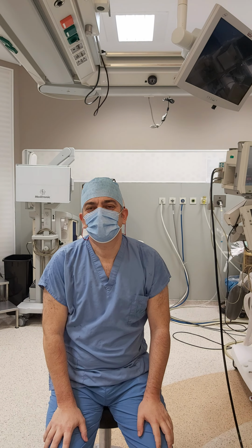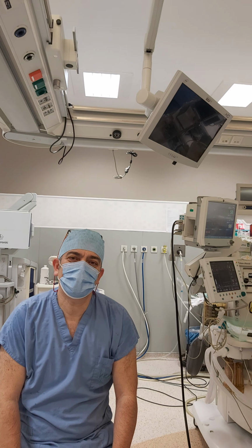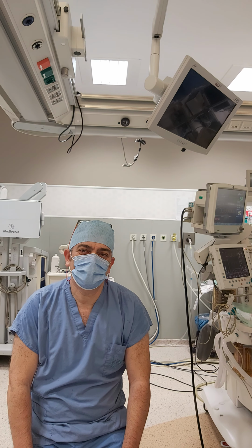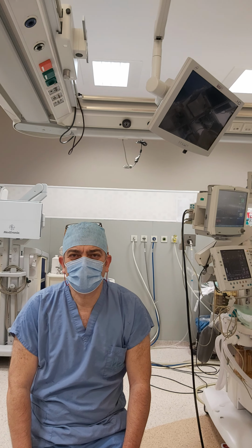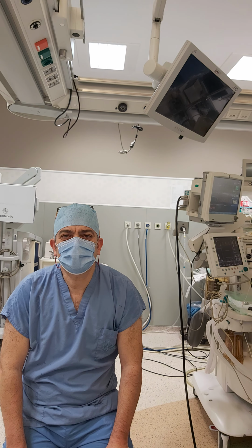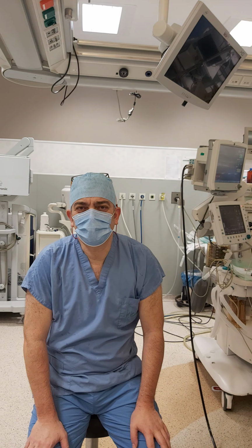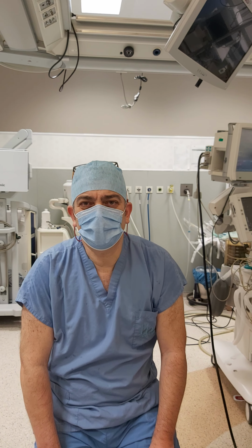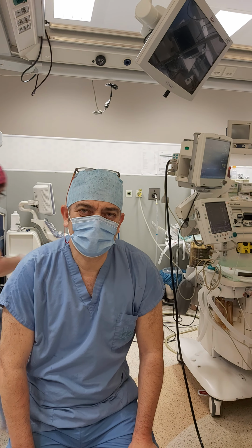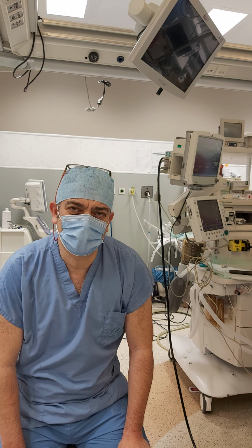Okay, this lady came to us from a foreign country, and she previously asked me to make a comment about her previous fulguration. She said she had the fulguration before in her country and sent me the cystoscopy views. It's very difficult to make a comment and to make a decision because I want to trust everyone. It is a simple procedure, it can be done, but it is not accepted in the urology world until now.